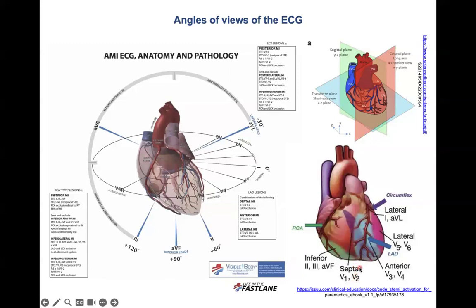V1 and 2, septal activity. V3 and 4, anterior. V5 and 6, lateral. And 1 and AVL also lateral, though from a different angle. I will discuss different pathologies in a different video.